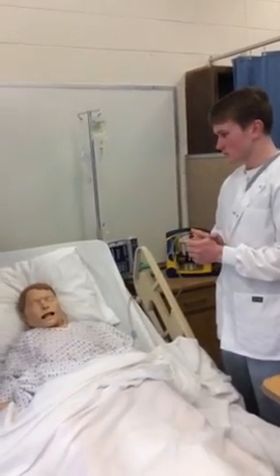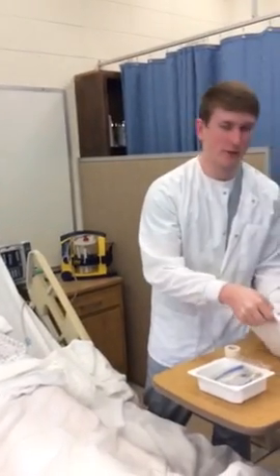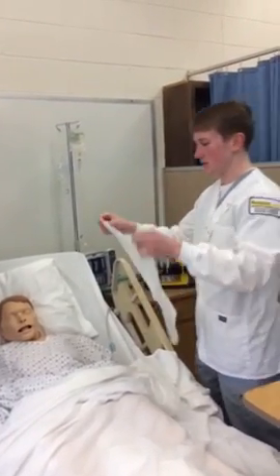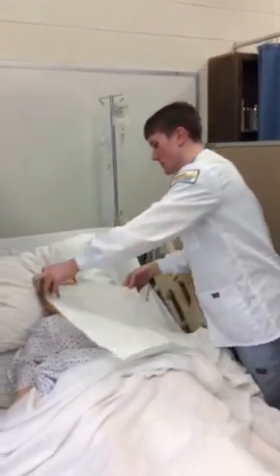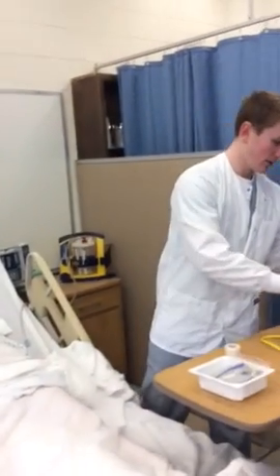And then drape their chest with a disposable pad or towel. Just got the disposable pad for now. And now I'm going to don my gloves.